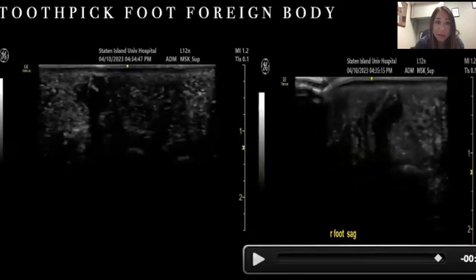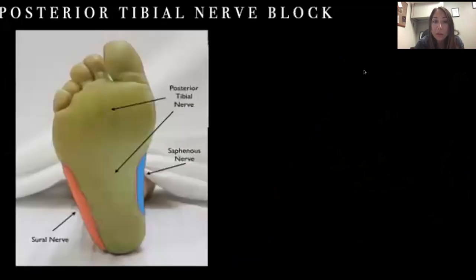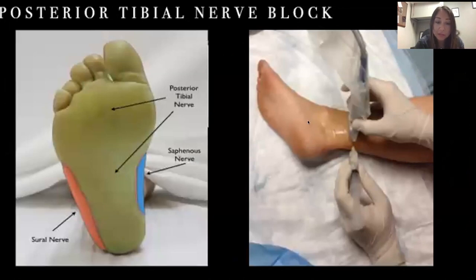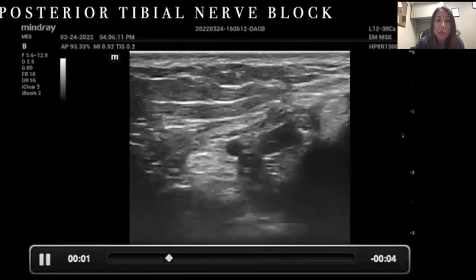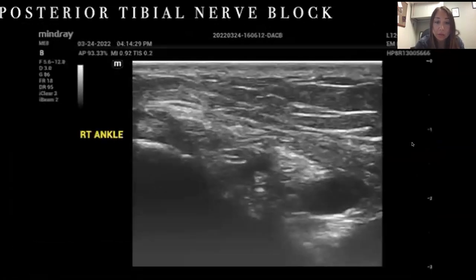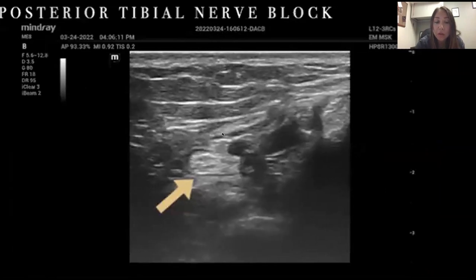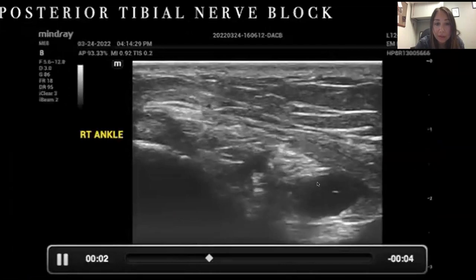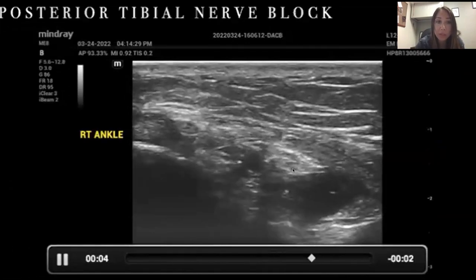In the ED we like to remove foreign bodies, especially in the foot. We use a posterior tibial nerve block to anesthetize the area. To find the posterior tibial nerve, locate the medial aspect of the foot right above the calcaneus — you'll find a honeycomb structure, which is the posterior tibial nerve, followed by the posterior tibial artery and vein. We inject anesthetic right to that nerve to anesthetize the sole of the foot. You can see all the black anechoic spread of anesthetic surrounding the honeycomb structure of the posterior tibial nerve.